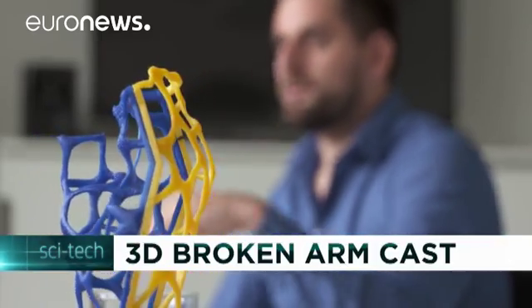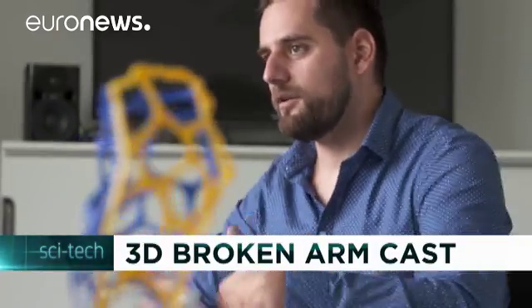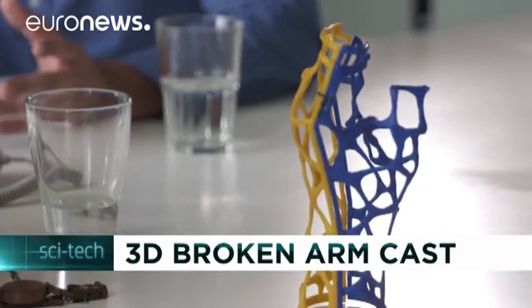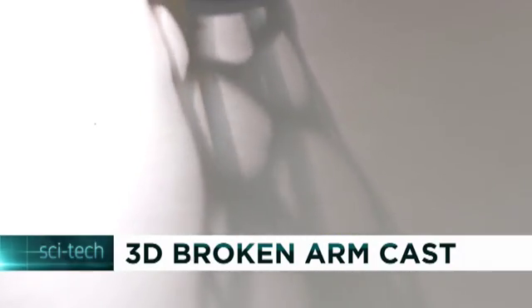The team is looking for an investor to equip the hospital with the machines needed to create the plastic casts, from scanner to printer. Miklos hopes tests can start by the end of the year, with the aim of making the 3D printed casts accessible to patients within two years.